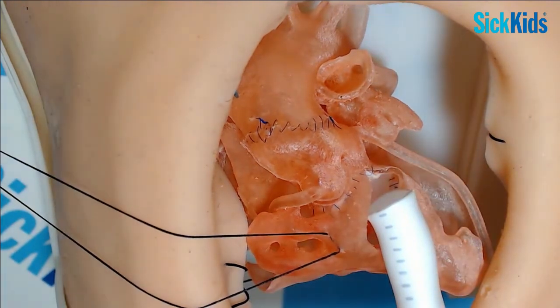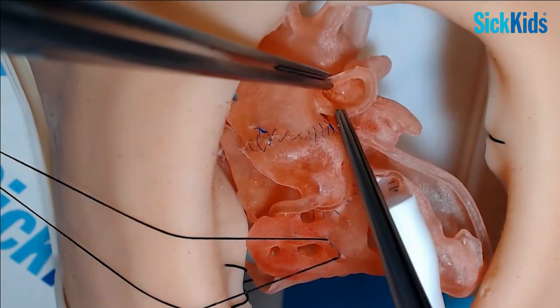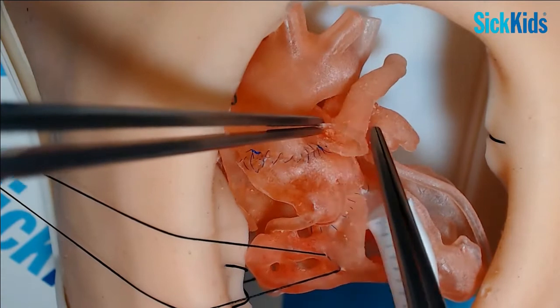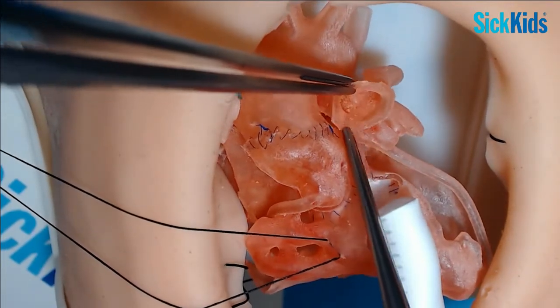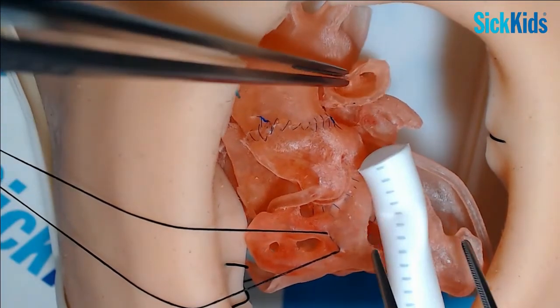But if you leave yourself a nice cuff of aortic wall, of truncal wall around your pulmonary arteries, it's much nicer to sew to than going right onto the edge of the pulmonary arteries themselves, which are quite thin-walled and more difficult to sew to. So if you can leave a little cuff like that, it's much easier to connect your conduit in.